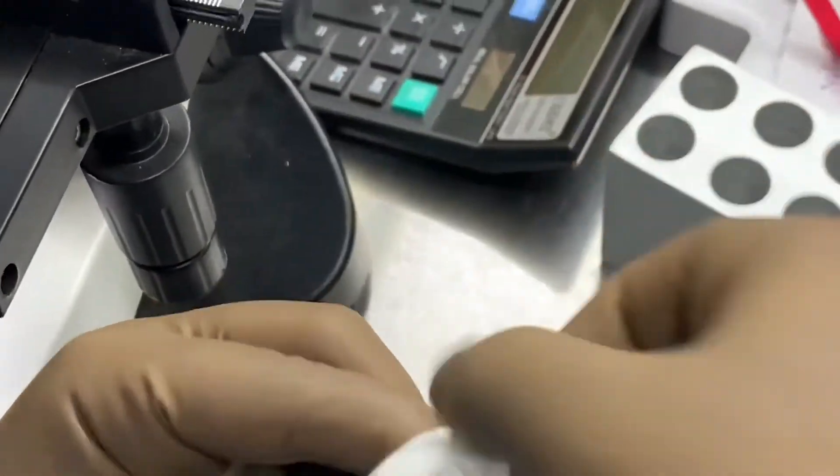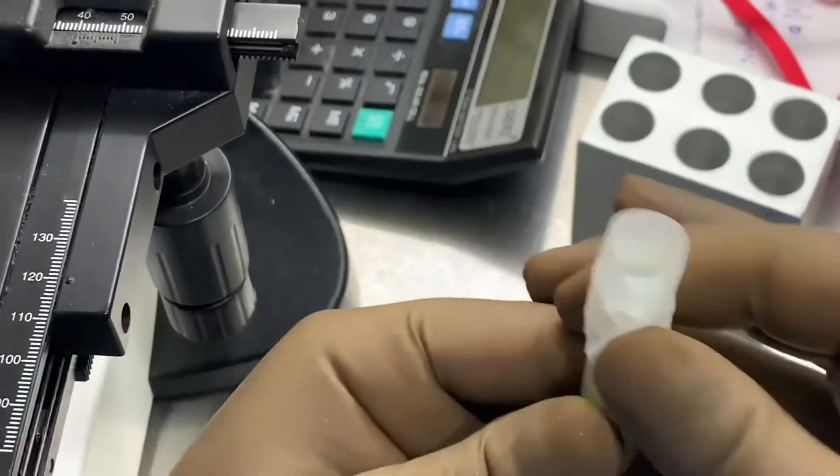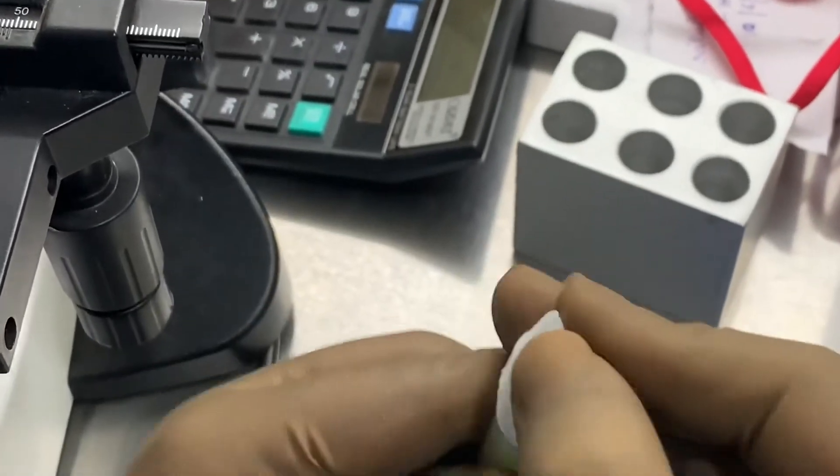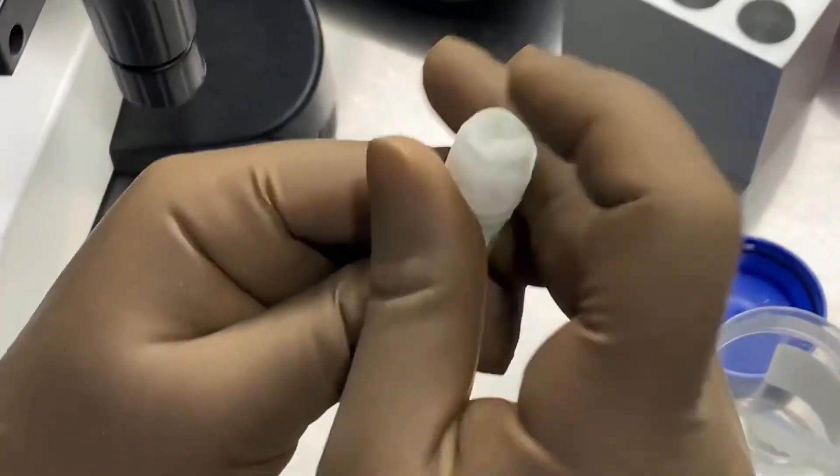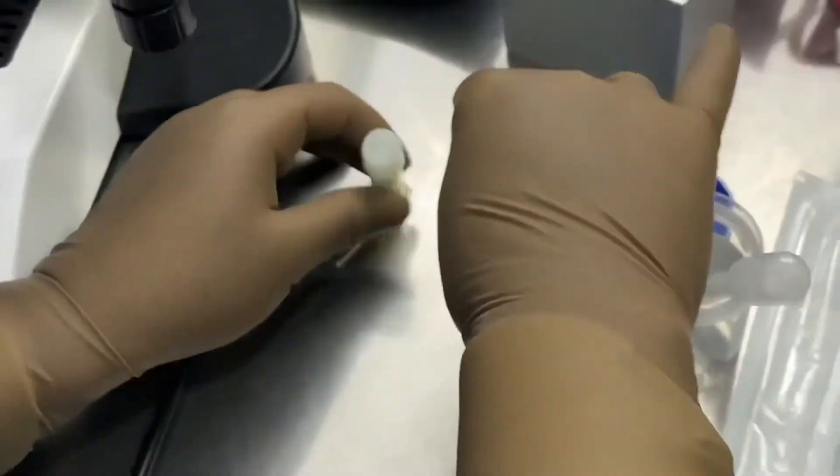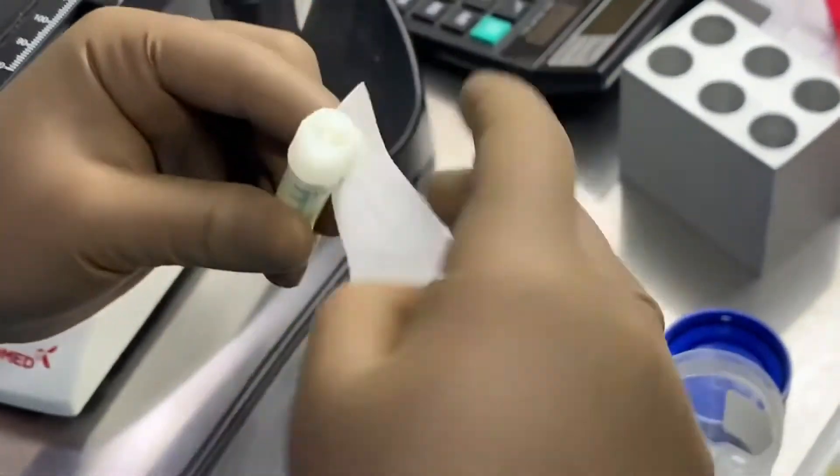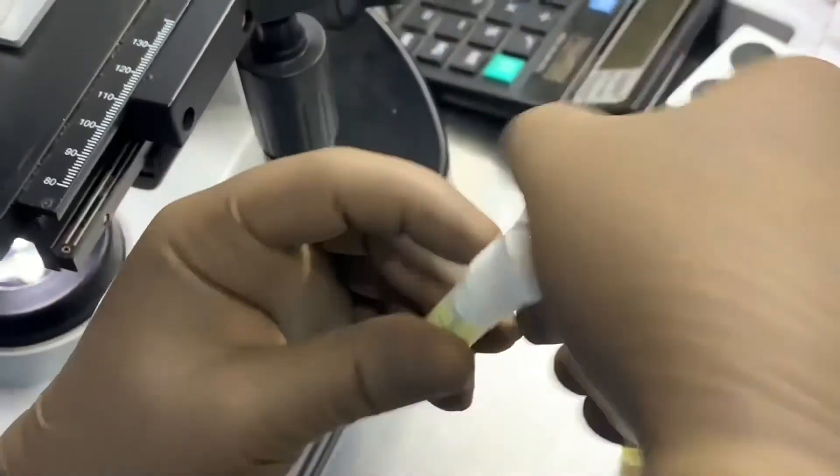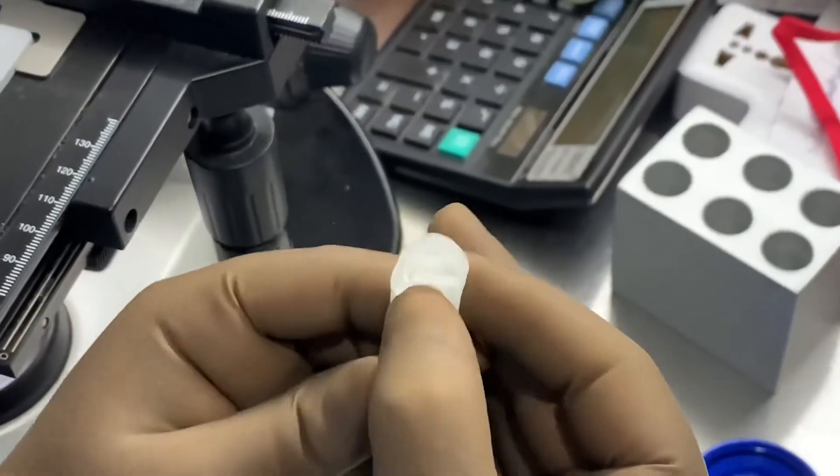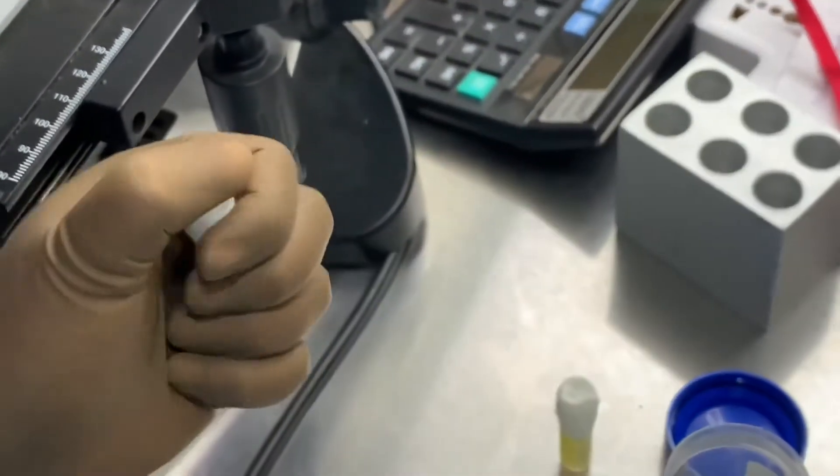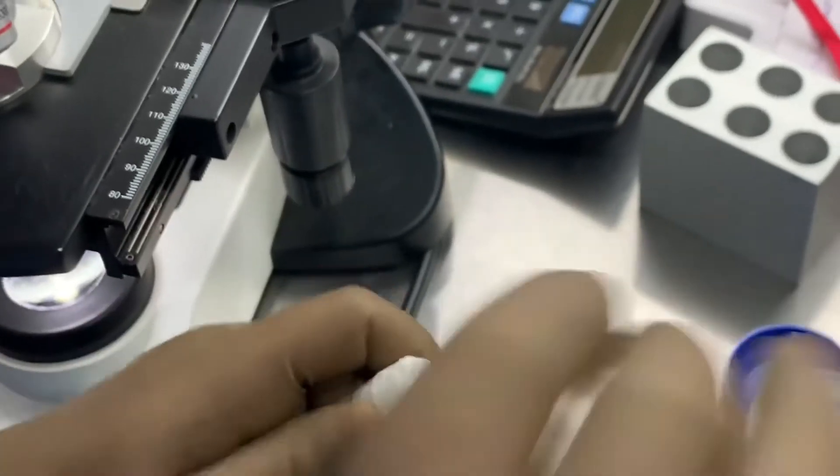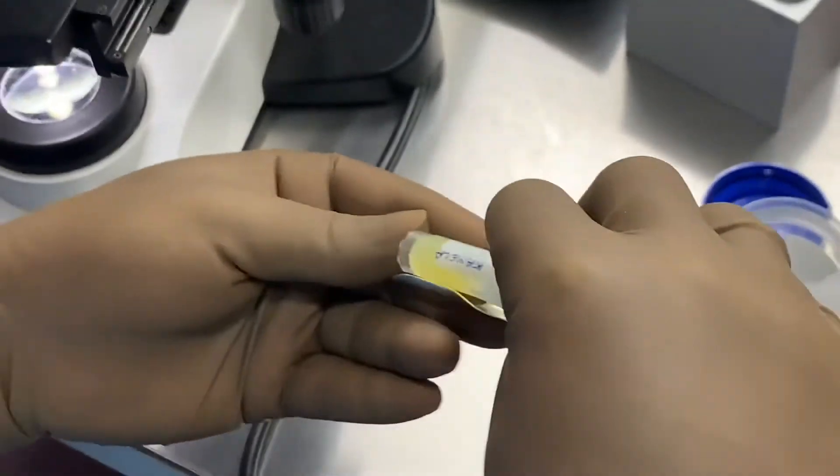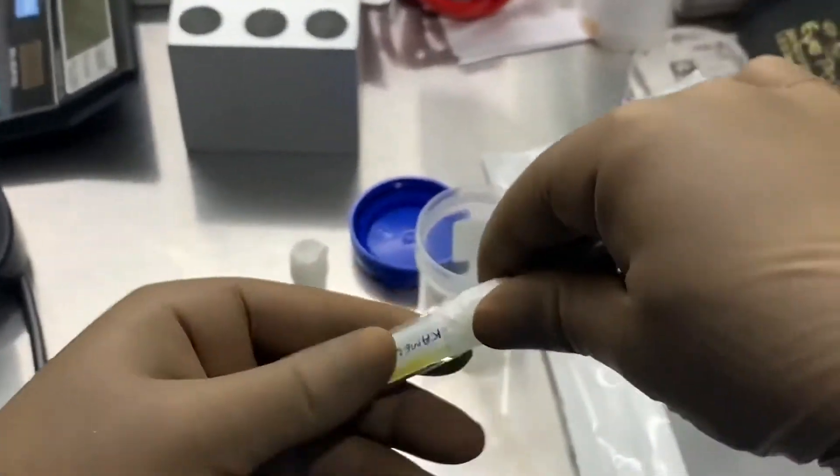Here we can see that we are sealing that particular cryovial with a micropore. So it will be double ensuring that there won't be any kind of spillage inside the liquid nitrogen. At least half an hour and then it will be plunged, totally emerged inside the liquid nitrogen.